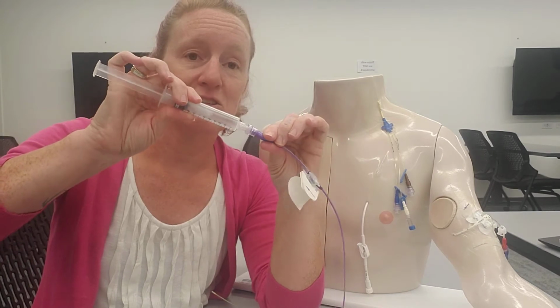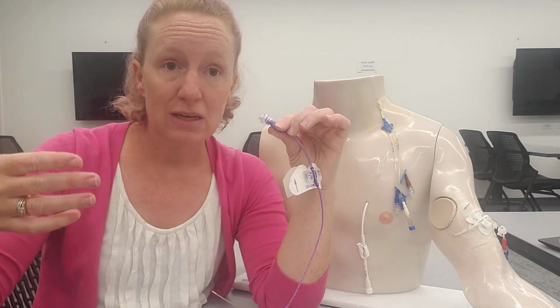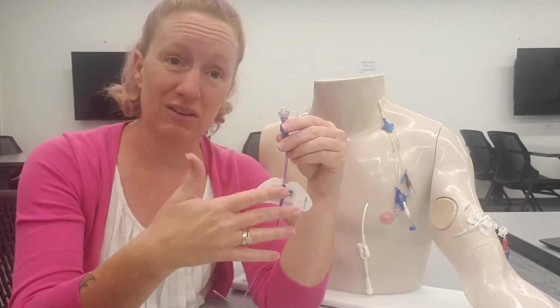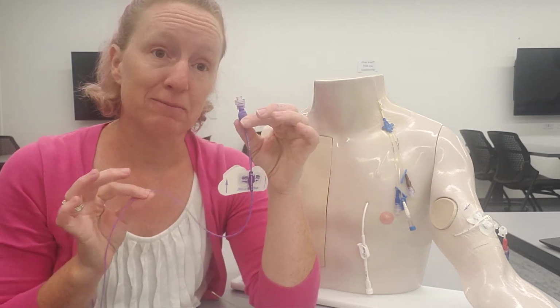In a central line, LPNs cannot initiate access, which means if I've got somebody right here, sorry, my table's kind of wiggling. If I've got somebody right here, I cannot do this with this one. I cannot initiate the access. If it already has something flowing through it, I can add to it, but I can't initiate access. Registered nurses, they can kind of do everything with these. Very special registered nurses put these in.